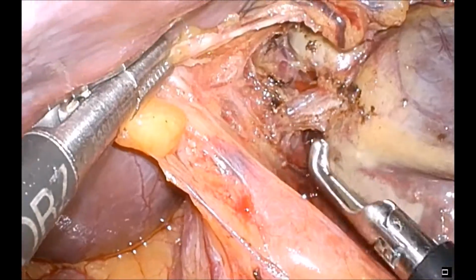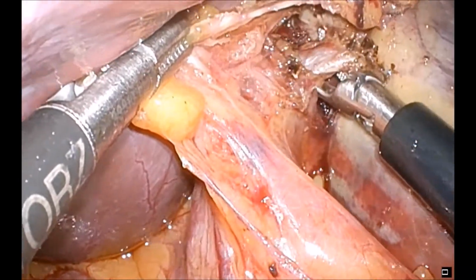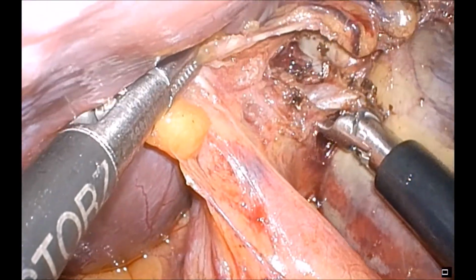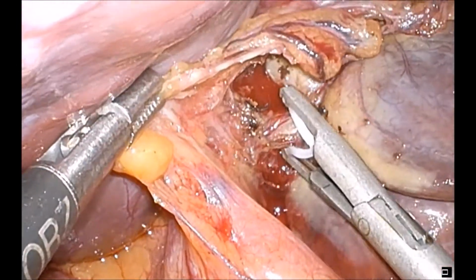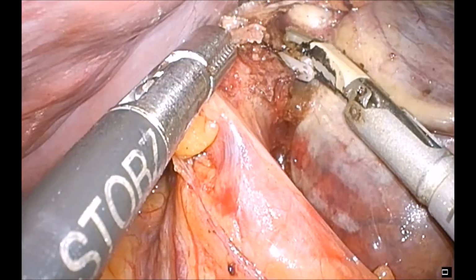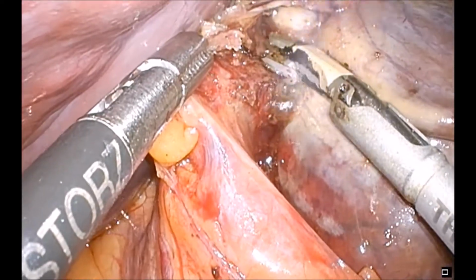This was the main feeding vein that we found, and possibly a small artery is torn at the back as we go round with the right angle, but it doesn't cause too much in the way of troublesome bleeding and is dealt with by the bipolar.